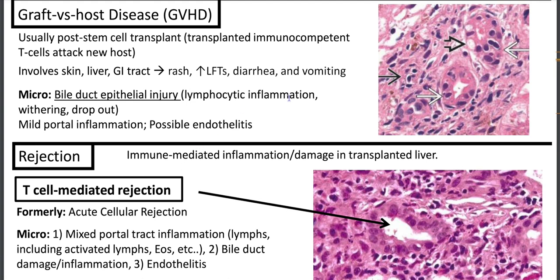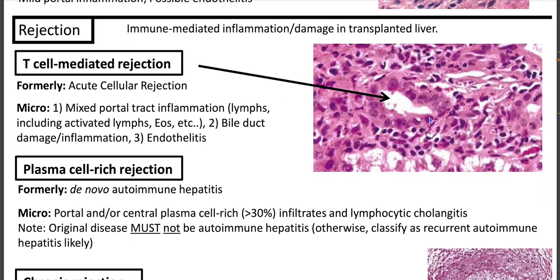Look for bile duct epithelial injury, where you'll see lymphocytic inflammation, withering and dropout of your bile ducts, mild portal inflammation, and possible endothelitis.